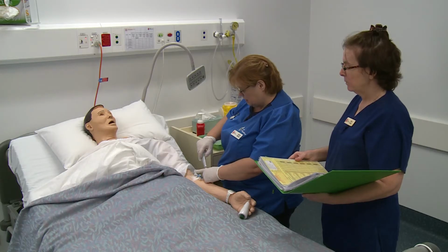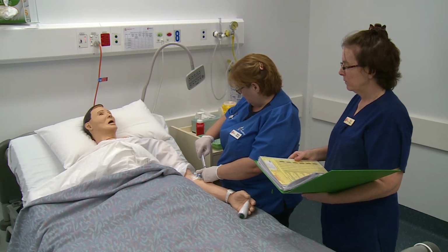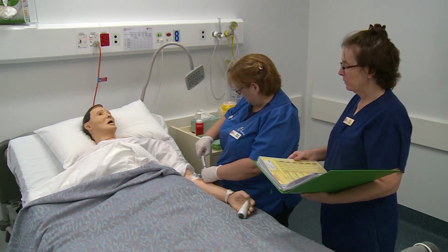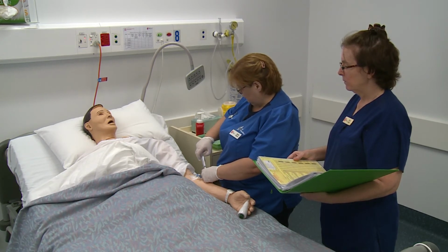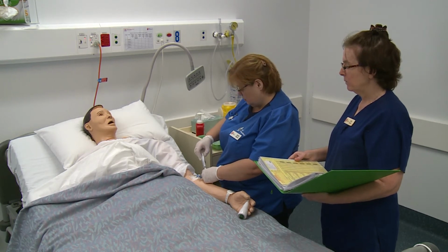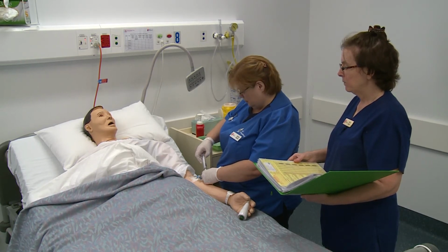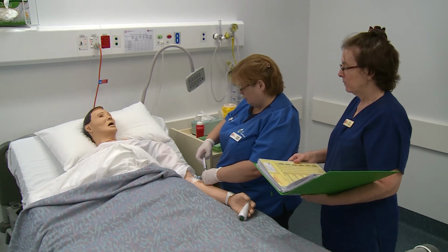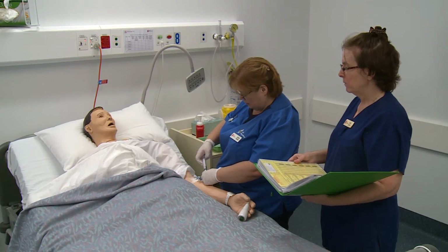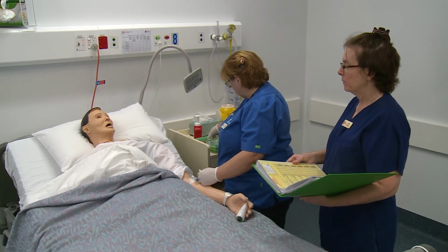All the while I'm checking for signs of any extravasation or infiltration, and checking for any resistance as well. That's flushing nicely. There's no resistance there and there's no signs of infiltration or extravasation occurring. How does that feel for you? Comfortable? Okay, so that's the pre-flush done.